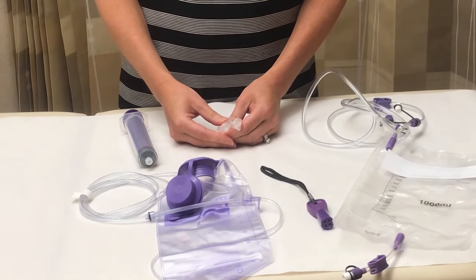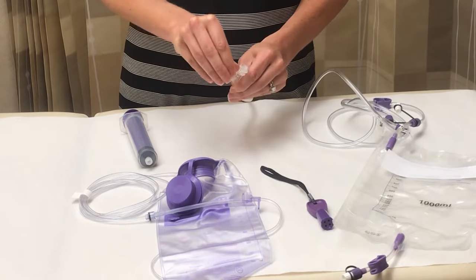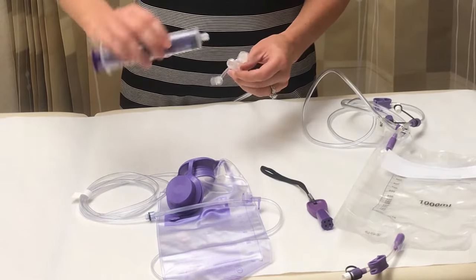First, your syringes will look differently. Instead of inserting your syringe into the tube, you will need to screw the syringe onto the end of your tube.